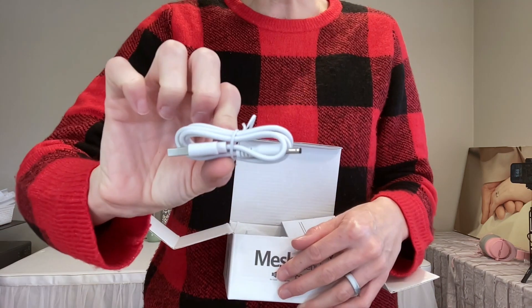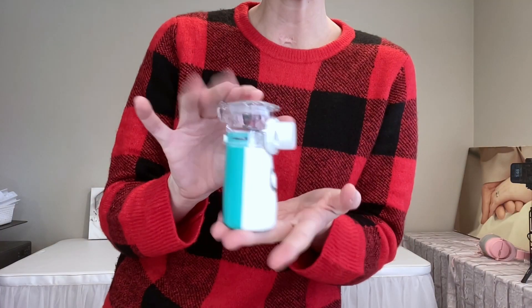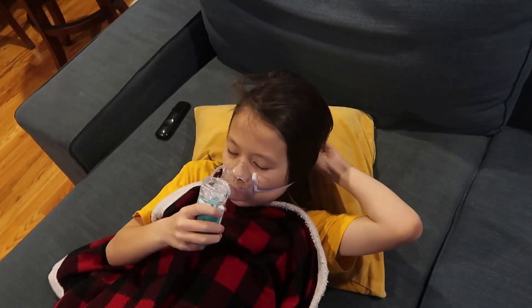It comes with a nice carry pouch, a standard USB charger, the user manual, the teeny tiny lightweight nebulizer, a very soft silicone mouthpiece or nozzle, and two masks — one for adults and one for children. All of which can be used while sitting up or while laying down.